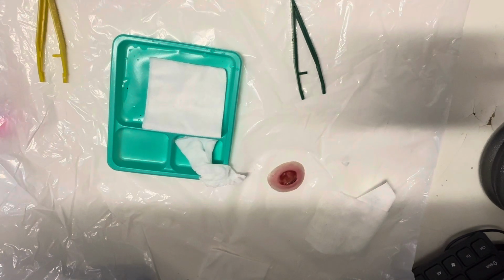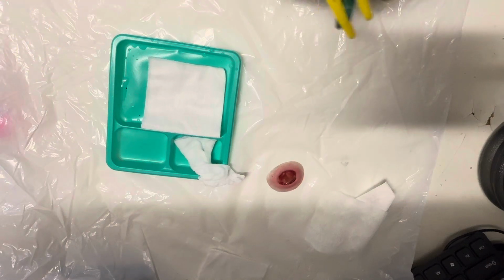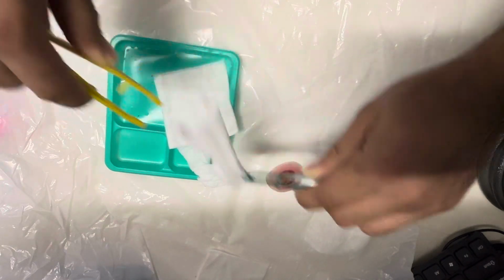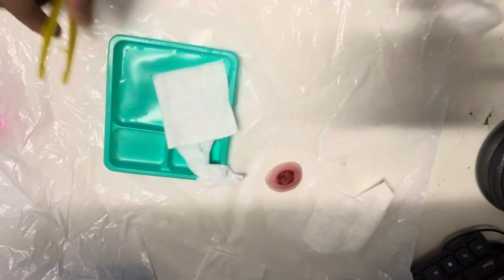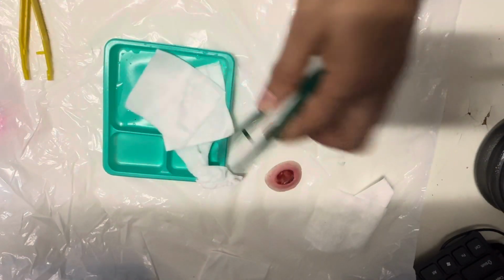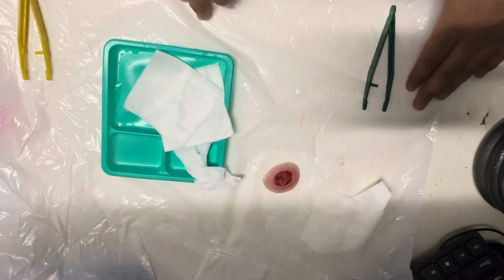Once you have everything done, you always need to make sure that you are using ANTT, which is aseptic non-touch technique. That means that if you are using this forceps, it should always stay here, and if you go to the wound like this, this forceps should never go there. Basically this is a forceps, I'm always misspelling this as a tongue. So once that is done, I'll tell you how to do the wound assessment.